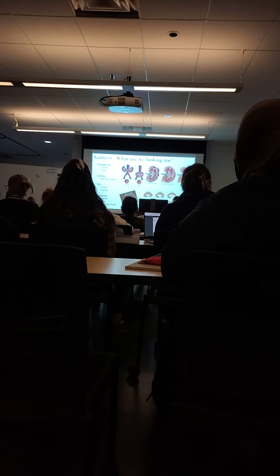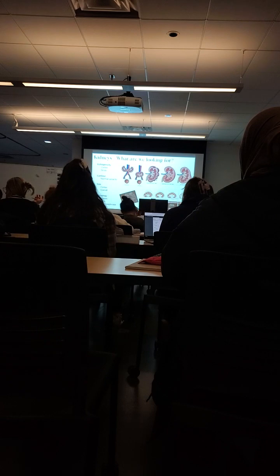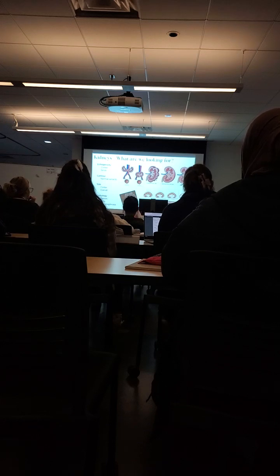Pathology: there's mass, cyst, hydronephrosis. Here's hydro, by the way, what it looks like. We know that this should be echogenic here, or hyperechoic. And so there's different grades to how bad the fluid can get. These are just the different grades, and you'll learn about them. On your worksheet, you'll end up having to say, is it mild, severe? They'll give you a little rating. And eventually you'll figure out what is what.